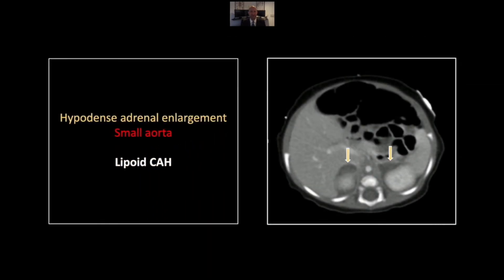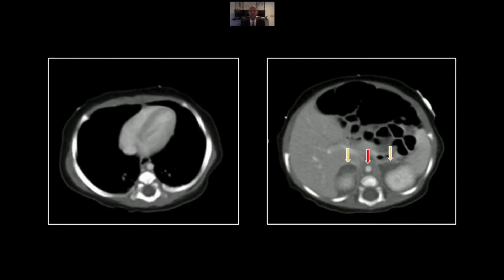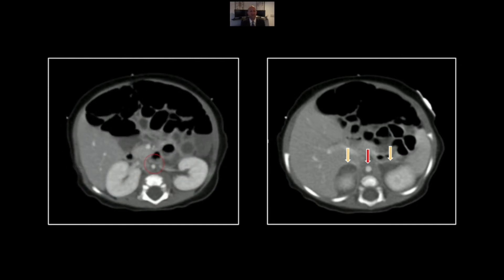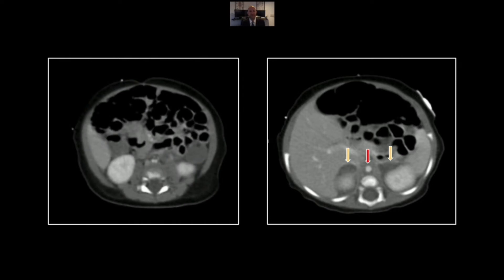Note the marked enlargement of both adrenal glands and the diffuse hypodensity consistent with fatty infiltration. These patients can have varying degrees of salt wasting depending on which exact enzyme in the creation of mineralocorticoid hormones is deficient. This patient did have significant salt wasting and persistent hypovolemia as evidenced by the diminutive size of his aorta. Note the enlargement and hypodensity and that diminutive aorta throughout its length.